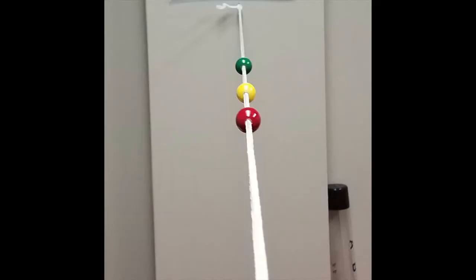I wanted to take a moment and talk about the Brock string in terms of both function and when it's appropriate to use. The Brock string is an optometric intervention that can be used. However, it should be used with caution because it can develop a splinter skill that then makes it more difficult for optometry to make an accurate diagnosis. It is a technique that can develop the kinesthetic awareness of vergence. However, you must be certain that there is a diagnosis for the same condition.